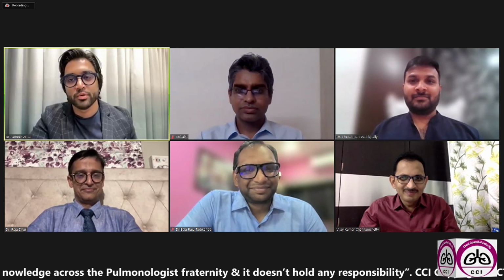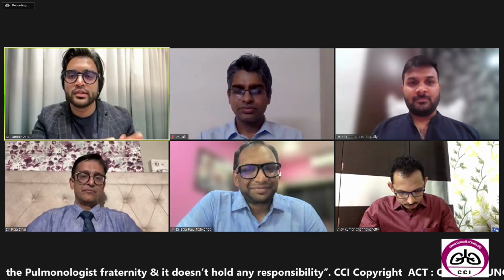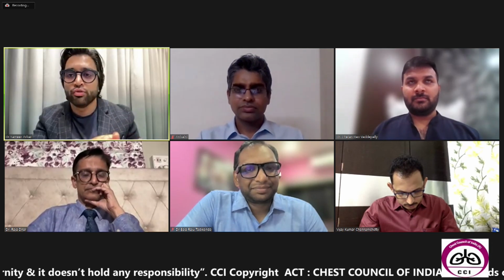Yeah. So I have pretty strong opinions on this. And this also comes through experience. I've exhausted 3 reusable probes, as in I've used them till they stopped working. And now the company is not giving any reusable probes. So the first thing that I've realized is, over the years, the indication for cryobiopsy in ILD has reduced. When we started, most of our cryo cases were ILD cases.